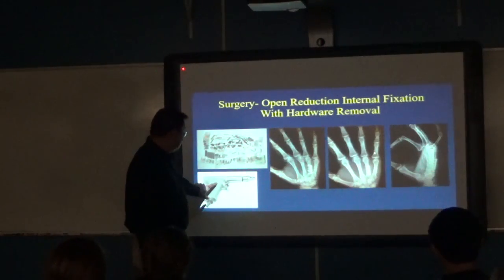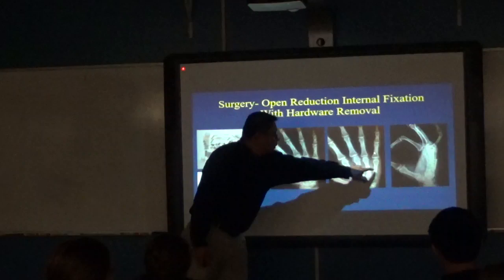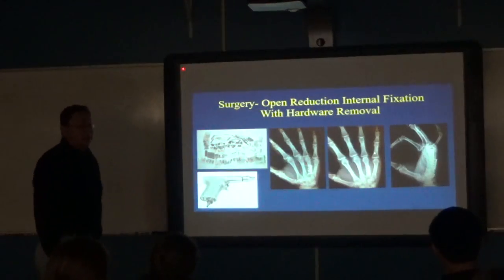These are plates and screws, there's our drill, plates and screws. It's called open reduction internal fixation.